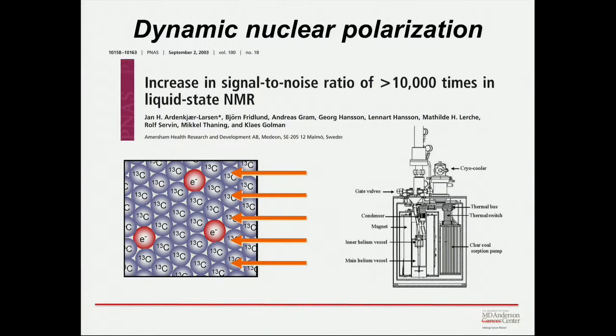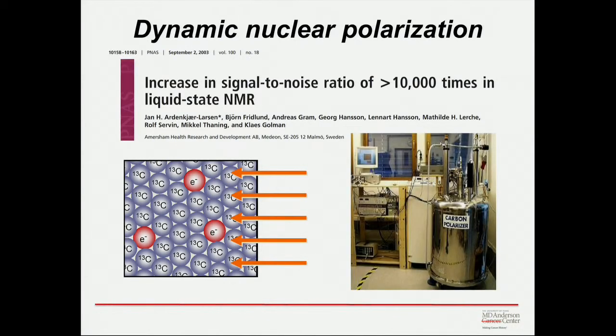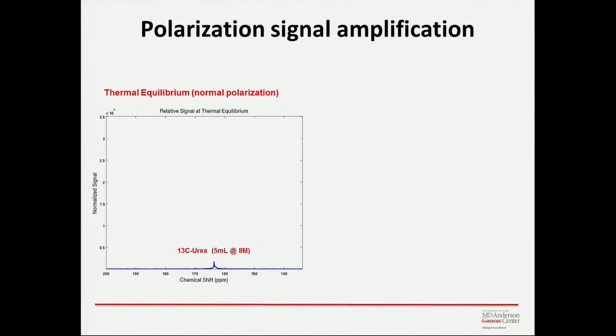You had to do this in a very sophisticated instrument that they came up with, I think theirs was actually a 3.3 T magnet. They had a helium vessel that they could put their sample down into, get near to 0 degrees K, bombard it, and then create a hyperpolarized compound that, when dissolved back into a liquid state, retained its hyperpolarization long enough to be detected. And that's the real trick.